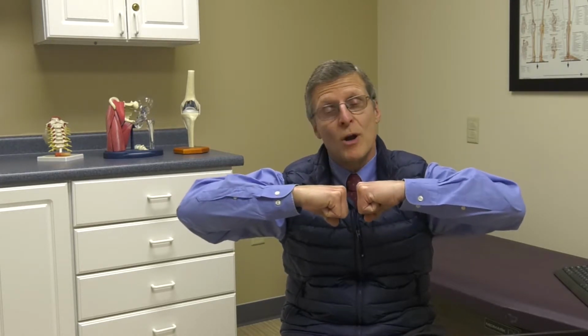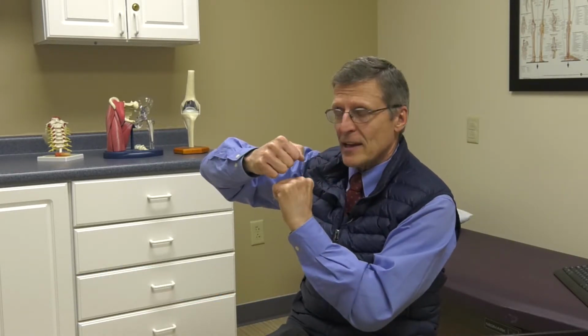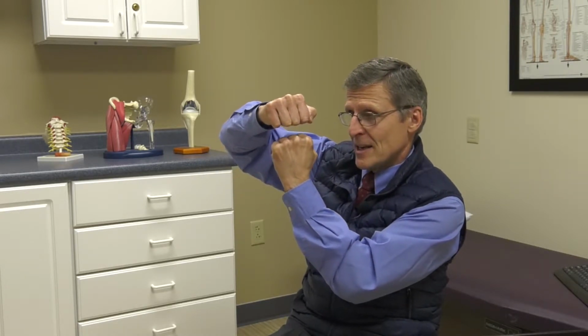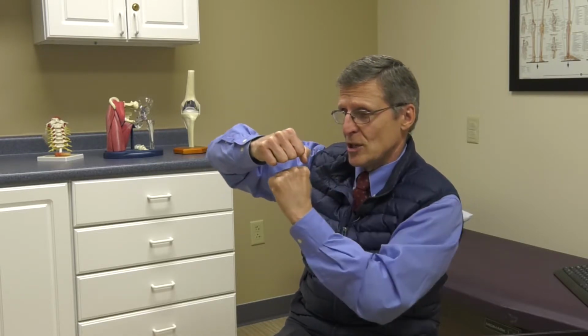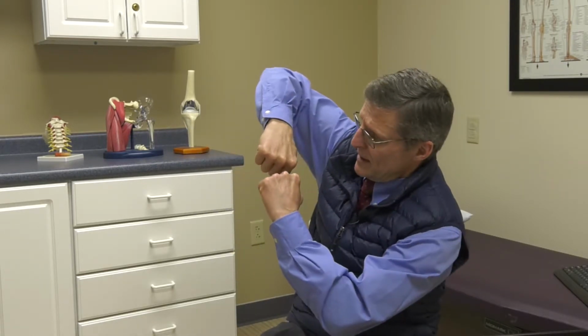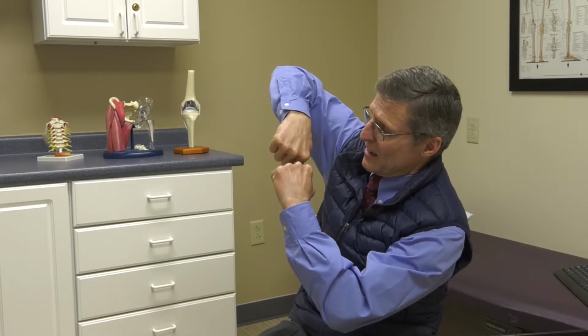We then register the extension gap. That's the gap between the femur and the tibia in extension once it's properly aligned. And then we measure the gap in flexion. Now, having done those releases, that may affect the gap, and it may be necessary in order to get a nice rectangular gap that is equal in both flexion and extension. It may be necessary to slightly rotate the femoral components so that there is good symmetry between the medial and lateral side. We want pure rectangular gaps and not trapezoidal gaps where there's a mismatch and a lack of balance.